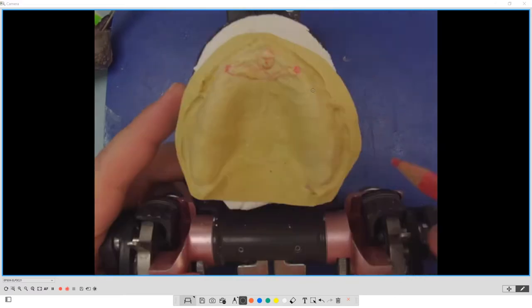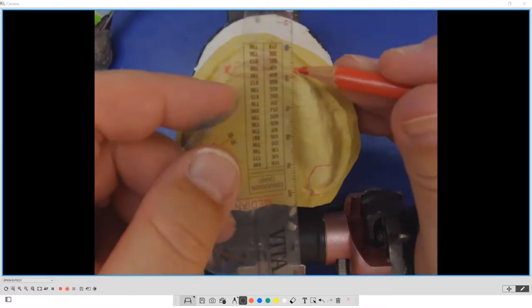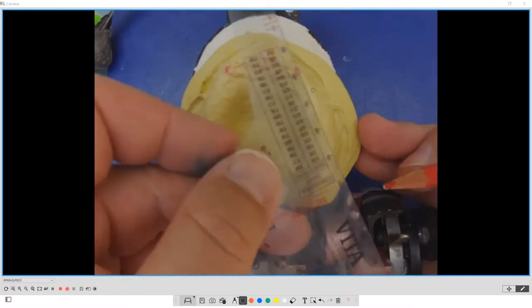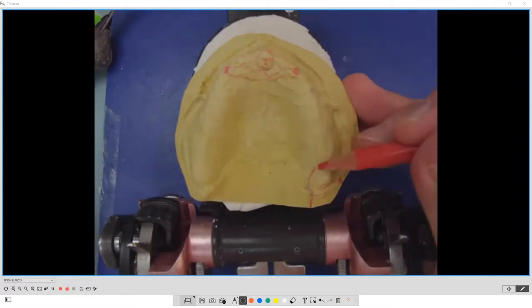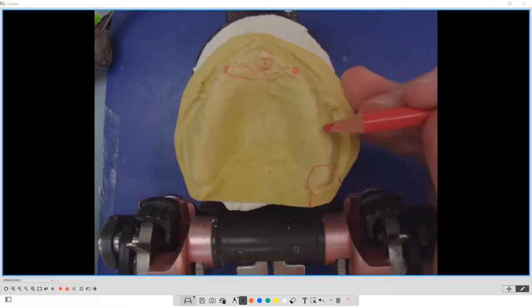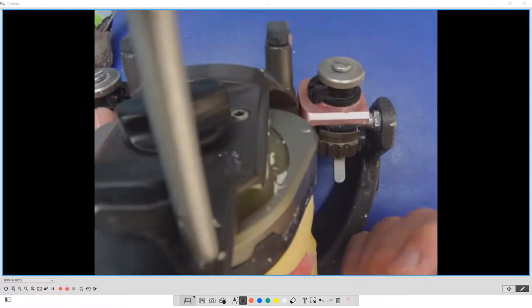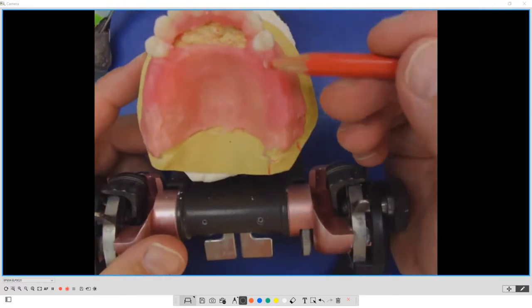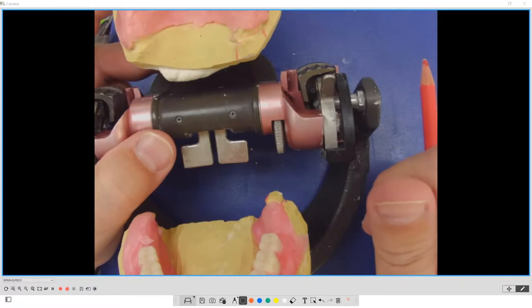We do that on the top because now we circle the tuberosities. And it's the same idea. So instead of the pad, I'm using now the cuspid, and I'm going to the inside part of the tuberosity with my line, and now I'm going to the outside part of the tuberosity. Okay, and this now puts that triangle zone here. So that's the best triangle zone limit for this upper quadrant. And then that allows me to work and then check so that when I set the posterior teeth, I'm not necessarily on the ridge, I'm within the triangles. And then what that does is that blends it for both so that I'm not letting one dictate the other. That's the beauty of model analysis.